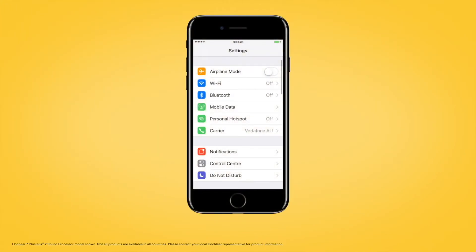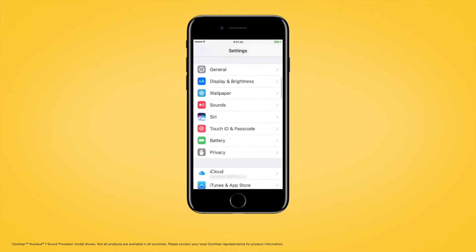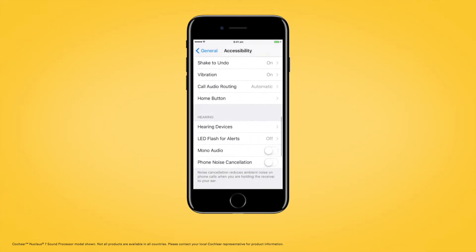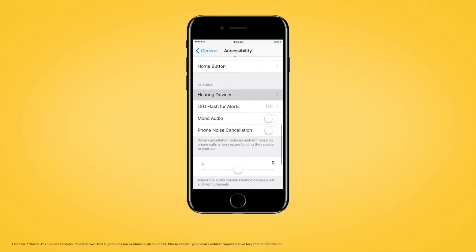First, go to Settings and tap General. Then tap Accessibility, scroll down, and select Hearing Devices.